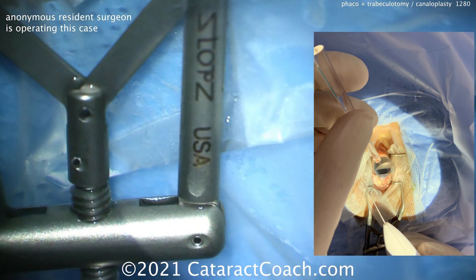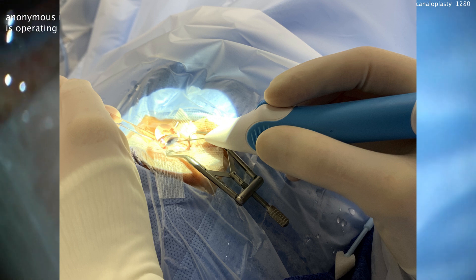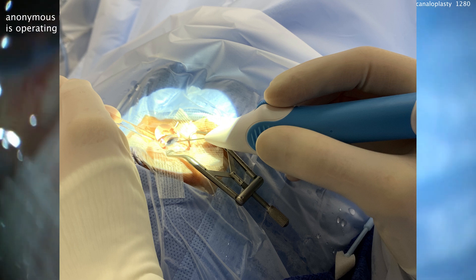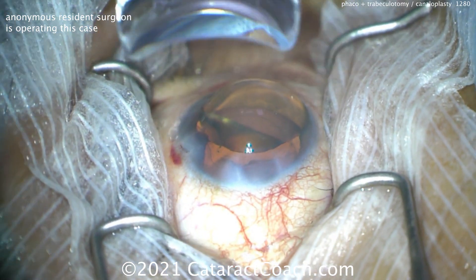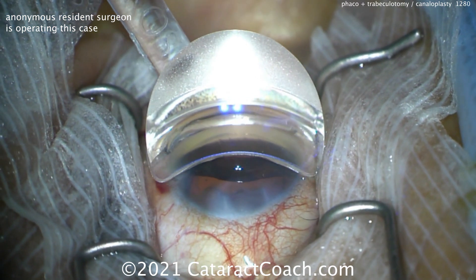Tilting the head — make sure the head's tilted exactly where you want it. That's the hand positioning. Look how far the eye is tilted away from the surgeon. So the Omni device is in the right hand and the gonio prism is in the left hand. Starting off, there's the gonio prism going on the eye. Get that lined up and look at that beautiful view of the angle.